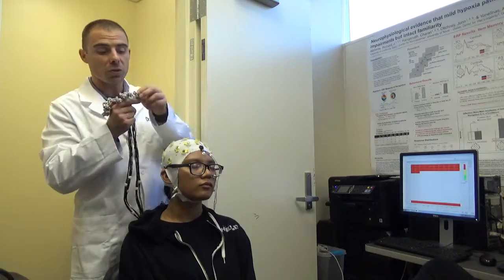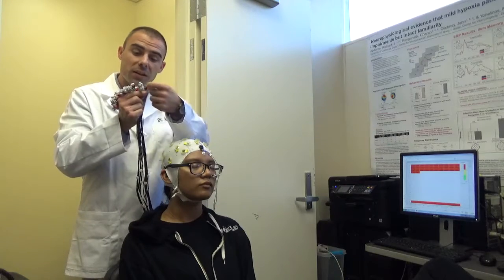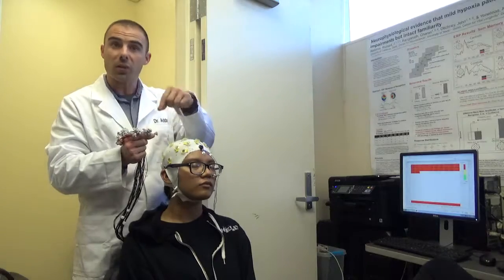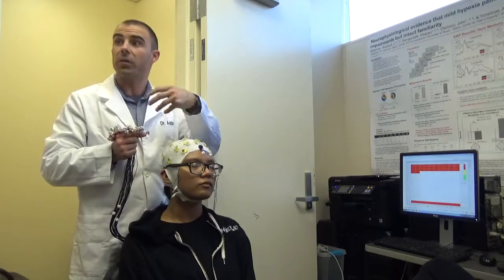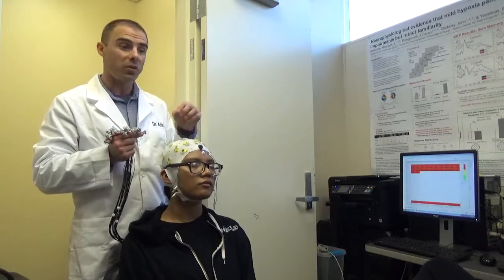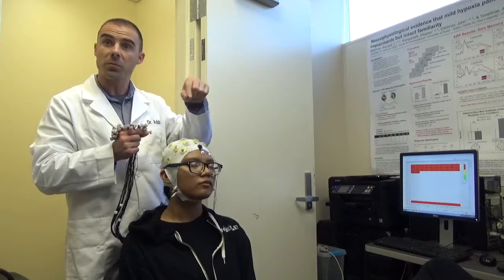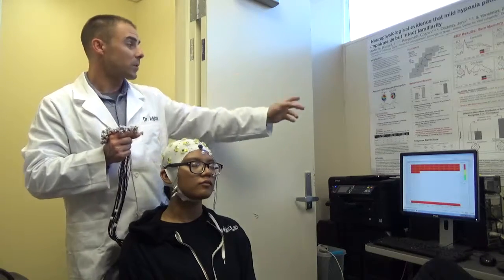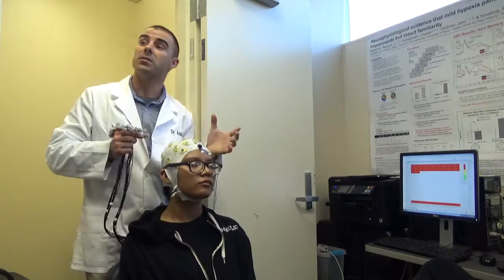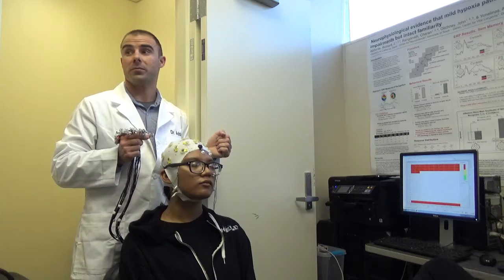And so what we'll do is we'll take those syringe tips, and we'll put them through this tiny little hole in there while this is in there, and we'll again work those sites very gently, very slowly, but methodically. People will each work a little section, and you'll see as you stay on the same electrode and keep circling and scraping very gently, those colors are going to start to change. Now, we do not start the study until all of them are green.